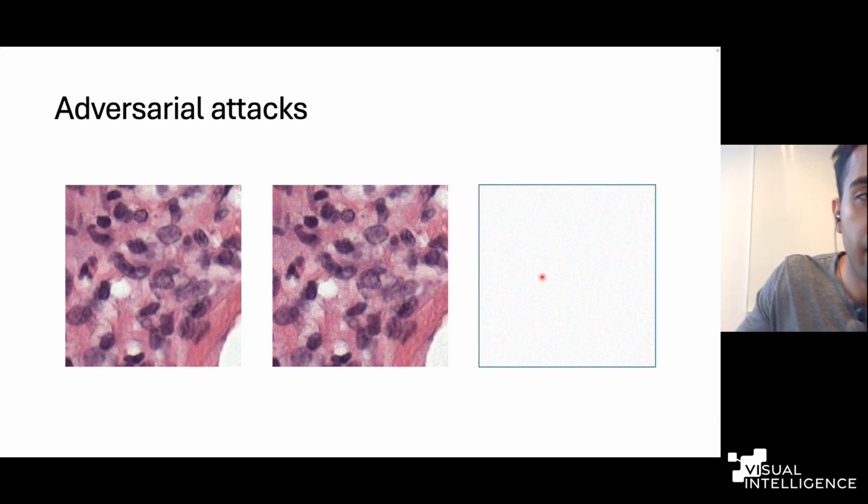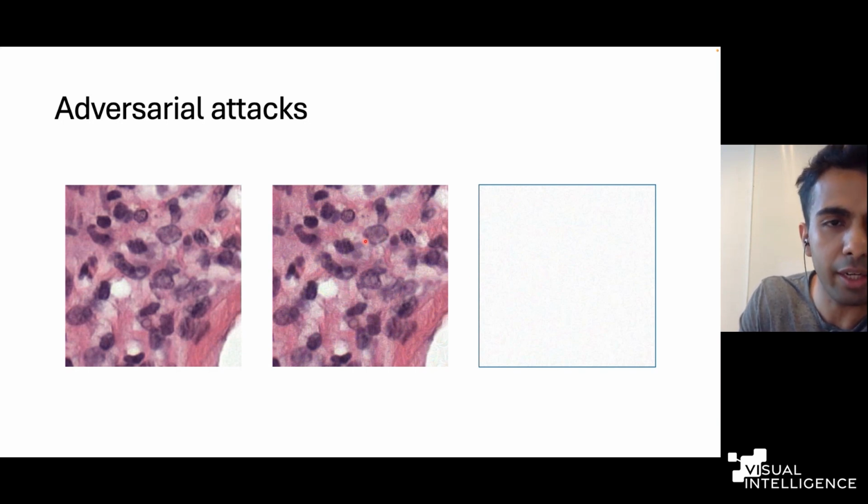The reason we thought that our model might be more robust to adversarial attacks was that since it is looking at very few things, as you saw from integrated gradients, it's looking only around the nuclei and the organization.